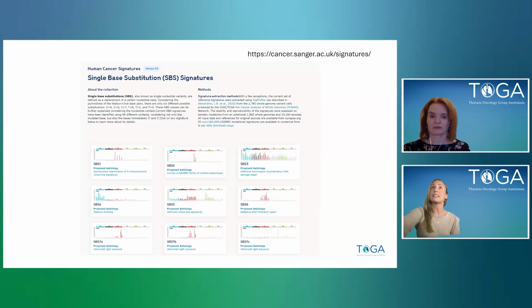And even within the COSMIC signatures, they look at different types. There's single-base substitution signatures. There's also small indel signatures. There's fusion signatures, all sorts. Again, within COSMIC, the most commonly clinically used, the SBS signatures, are probably by far the most commonly used ones. There's over 100 different SBS numbers pertaining to different mutational signatures.